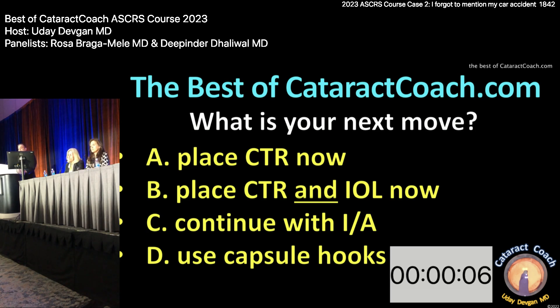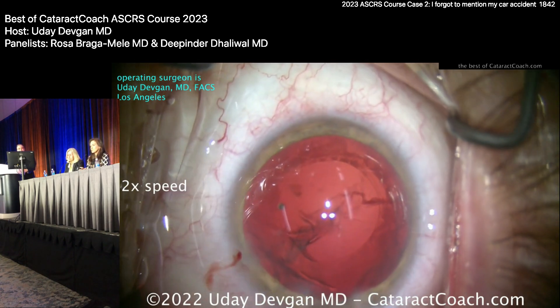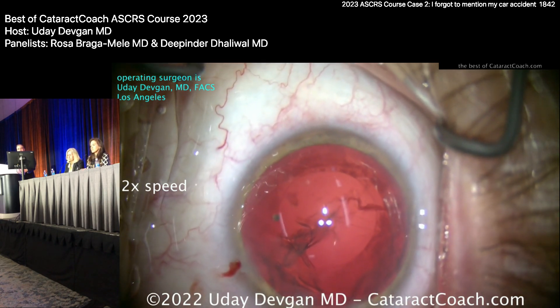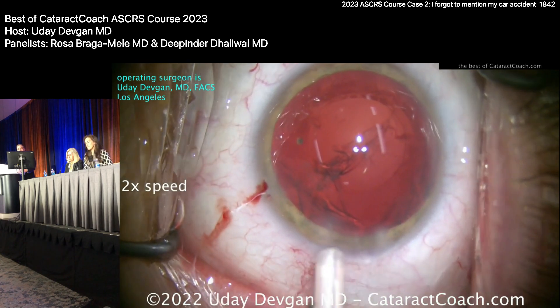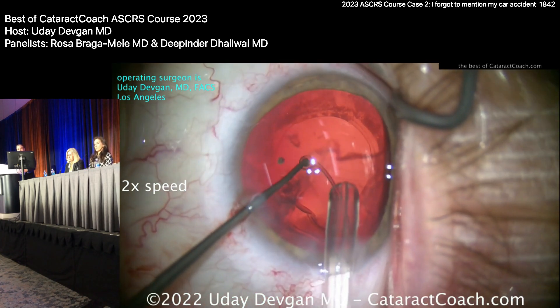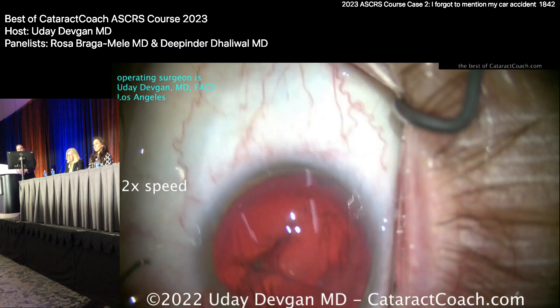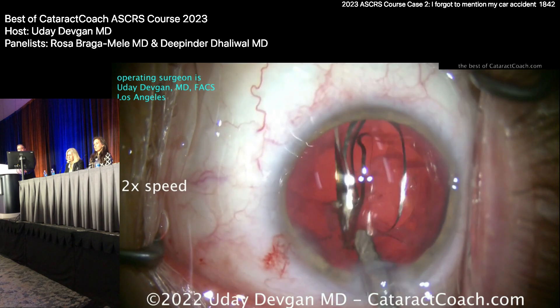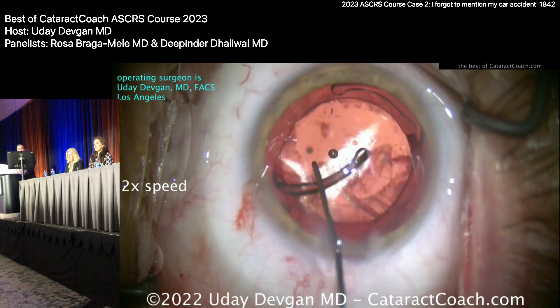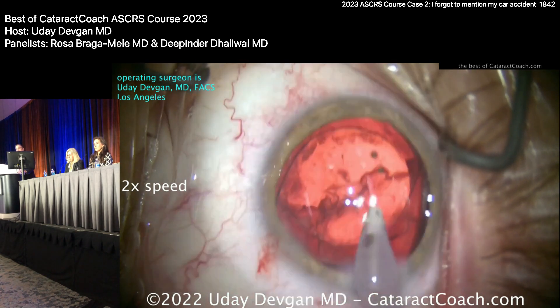BSS is going through that gap in the zonular support into the anterior vitreous face — the bag is collapsing. I'm worried if I don't get the lens in now, it won't be easy to expand the bag. Here comes the CTR; hooking it with the Sinskey hook. There we go — got it going around in the bag. Now putting the lens in — an EDOF lens, non-toric — getting it in the bag.